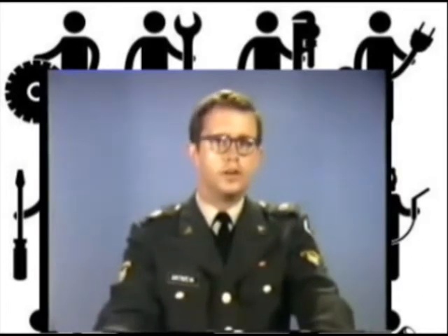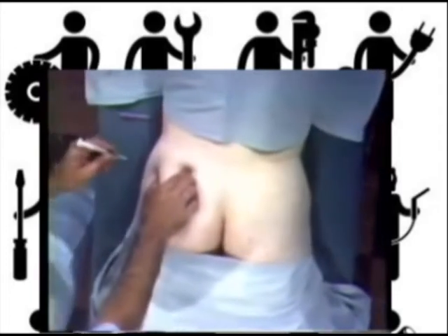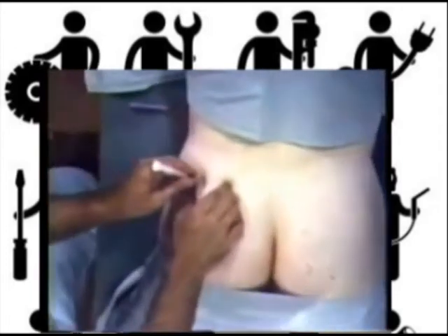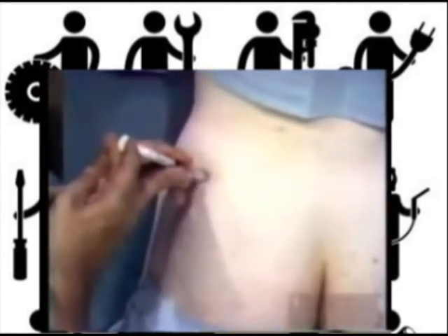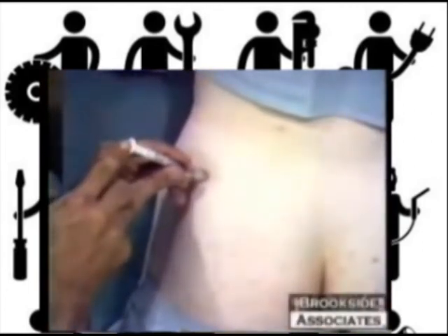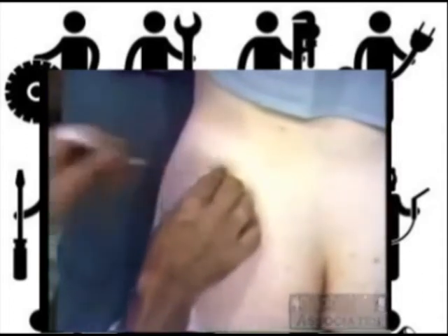Now using a disposable needle and syringe in the gluteal area. Clean the site. Firm the tissue. Inject at a 90-degree angle. Aspirate. Inject the medication. Withdraw the needle and syringe and massage.